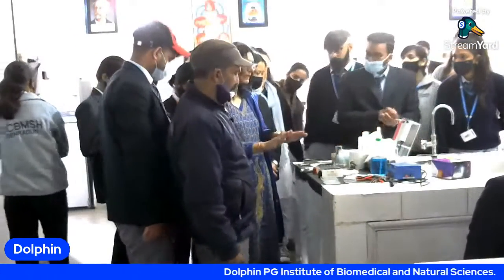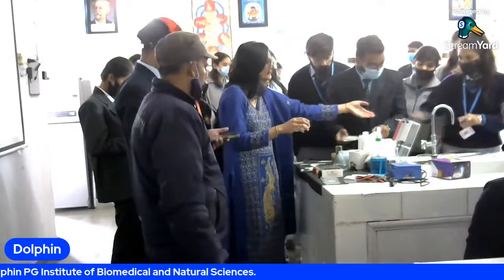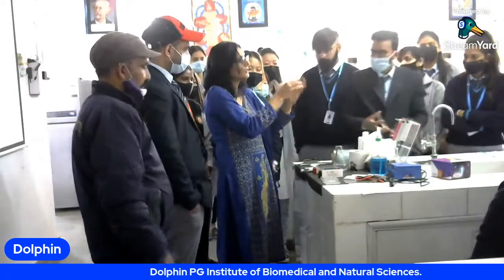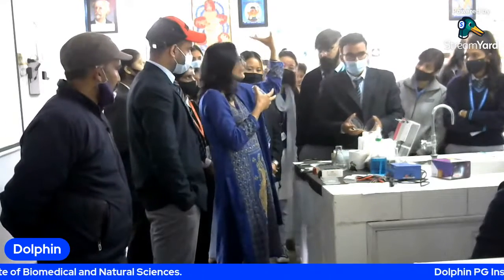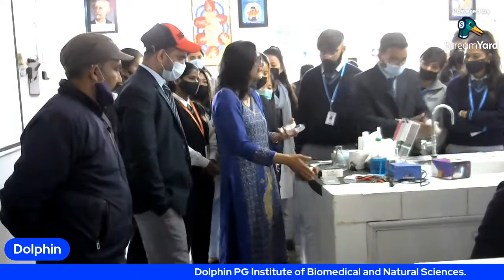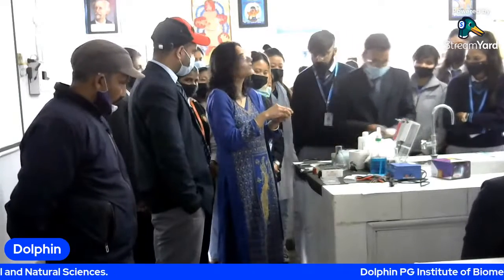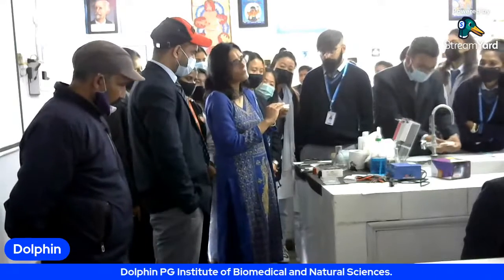After some time, let it get set. Then we will keep it in the moist chamber. This is the moist chamber. We have prepared it by soaking the cotton in the water. So this cotton is only damp, not wet. It should not be dripping. Okay, so it is just moist. And now let it get set. Then we'll keep the gel by removing the tapes in this chamber and keep it in the refrigerator for 30 minutes to allow the gel to set.